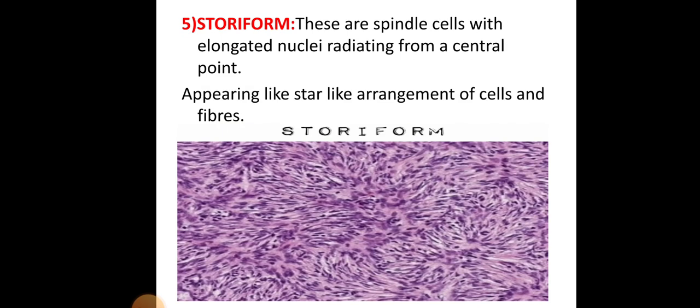The storiform pattern is where spindle cells with elongated nuclei radiate from a central point, appearing like a star-like arrangement of cells and fibres. This type of pattern is most commonly seen in dermatofibroma.